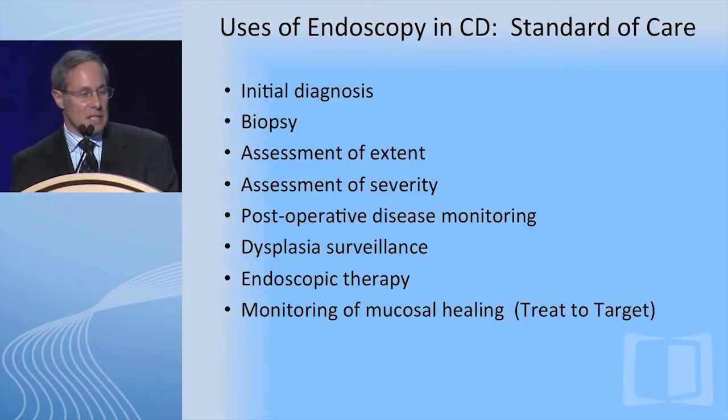Endoscopy in Crohn's disease is the standard of care for the initial diagnosis, biopsy confirmation and clarification, assessment of extent and severity, postoperative disease monitoring, dysplasia surveillance, endoscopic therapy, and monitoring of mucosal healing or treat to target.